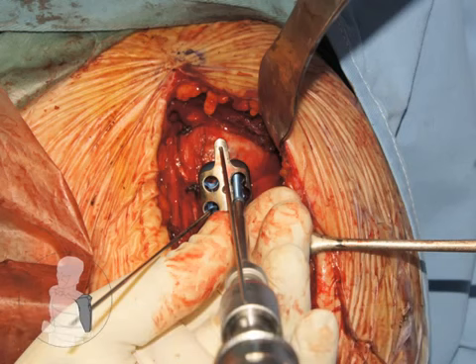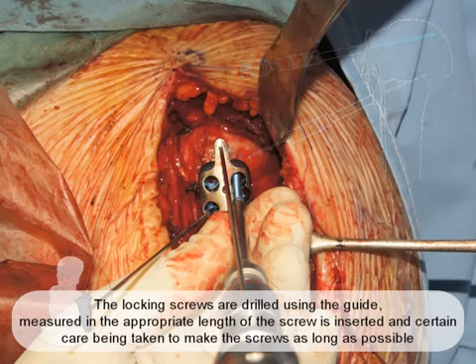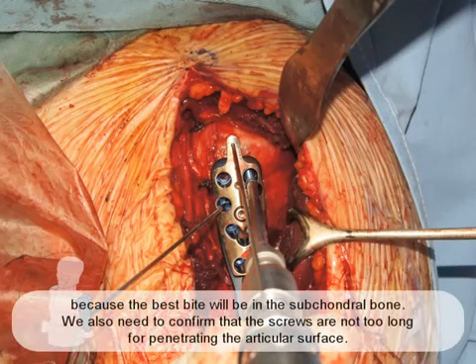Proximal fixation is obtained first, putting multiple screws into the head segment, and eventually we will then fix the head segment down to the shaft. The locking screws are drilled using the guide, measured, and the appropriate length of the screw is inserted, care being taken to make the screw as long as possible because the best bite will be in the subchondral bone.